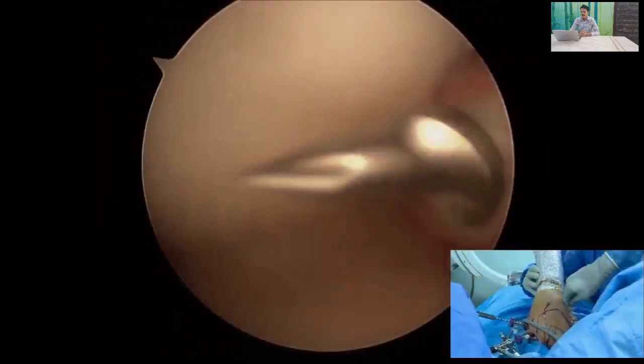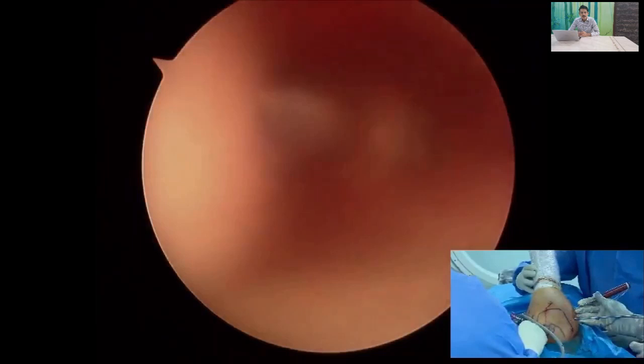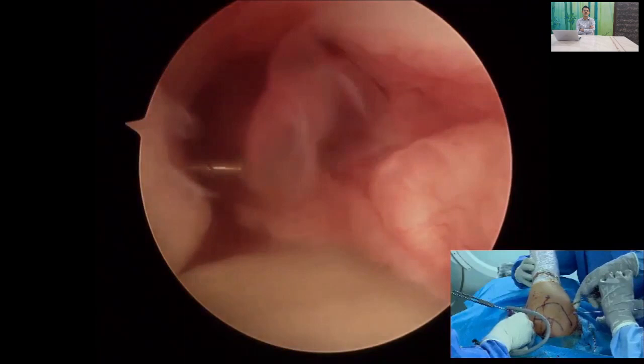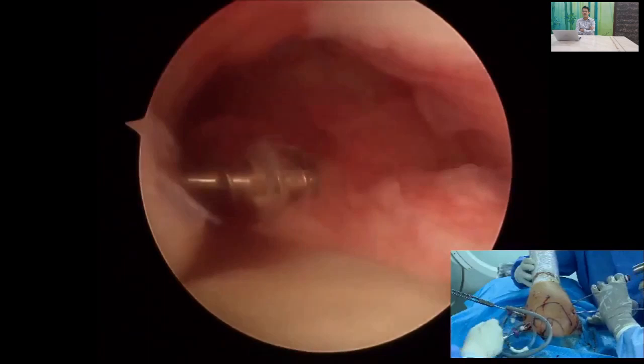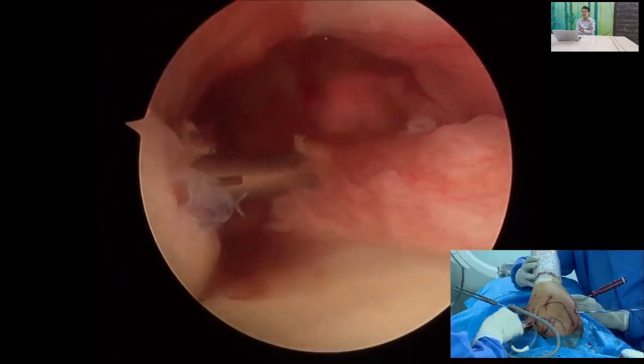We insert the remplissage anchor from the posterior lateral portal. In this case we are using a wedge metal anchor, inserted at the junction of the cartilage and the bone defect. The number of anchors depends on the size of the defect — if the defect is less than two centimeters you can use a single anchor. We use a double-loaded five-millimeter metal anchor, which is preferred because you can do it in a single step.